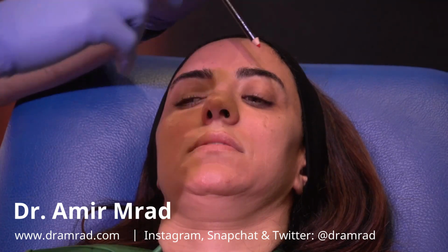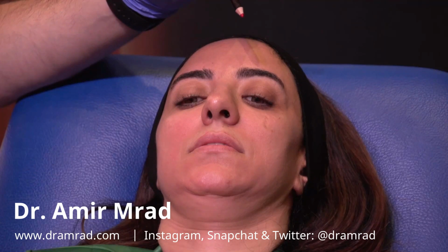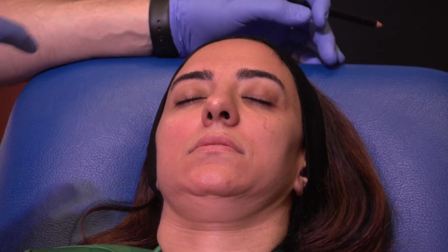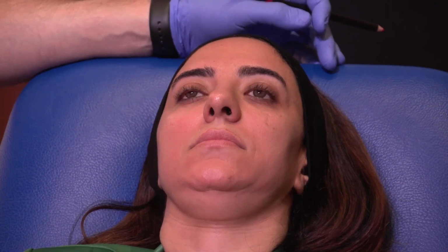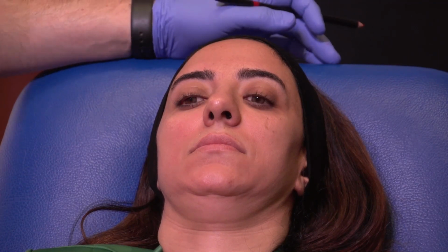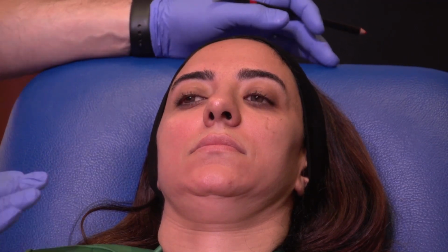And the way I do it is linear punctures within that vermilion border, upper and lower lip. I think it's painful. You might want to wait a little bit longer on your topical anesthesia, or you want to inject local in the nerves. So that's one technique. The other technique, which we've agreed on today, is that she has beautiful lips to start with.